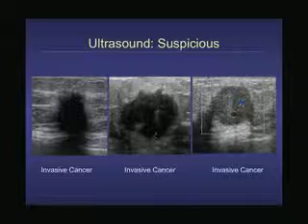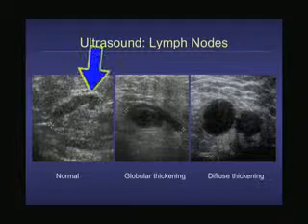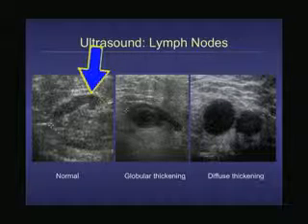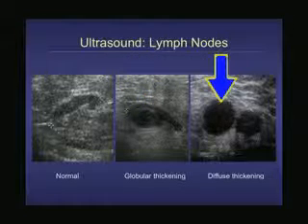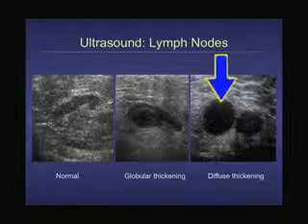They're very irregular, spiculated. Some will have color, sometimes they won't. But I don't need the color to tell me that this looks bad, right? They look very different. We can look at the lymph nodes. Lymph nodes look like little kidney beans. They have this little kidney bean shape to them. And when they start having these globular areas that look thick and dark, or we don't see any of the fat, they're just big and round, that's abnormal, and we can biopsy them and prove it.